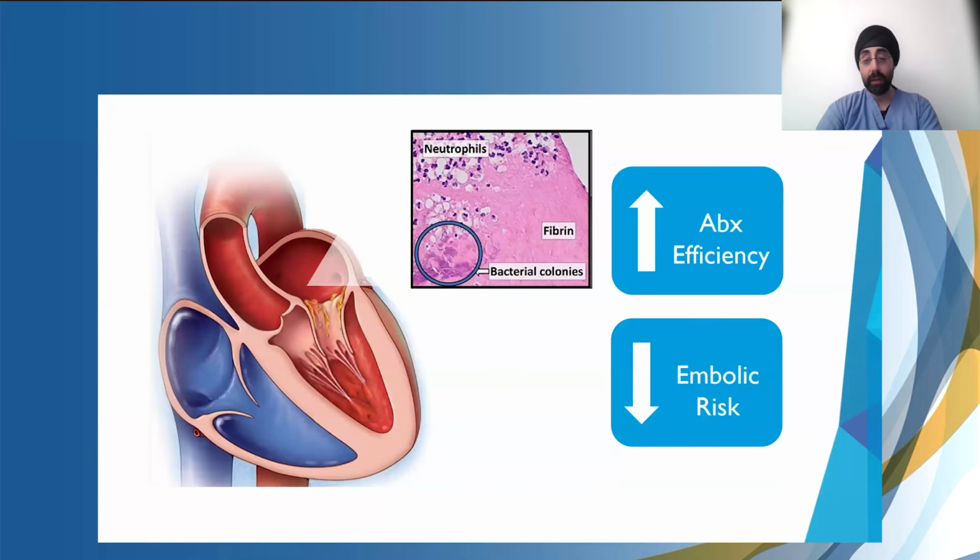Some patients may not need anything further beyond that. Some people, it may buy them time to be able to clear their infection to make them better surgical candidates. For some patients, it may be a bridge to eventual recovery and valve replacement.